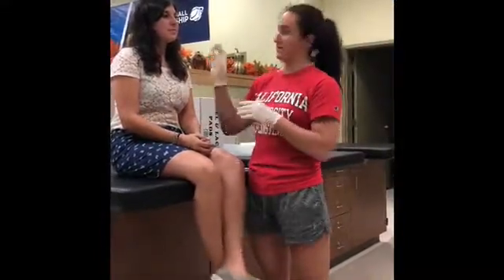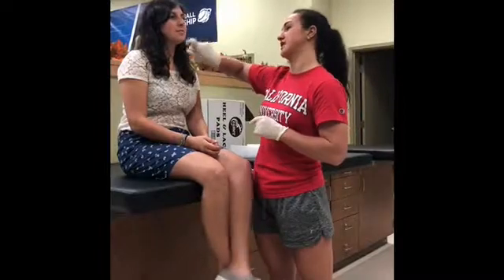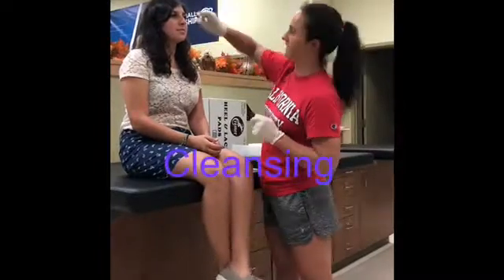First I put my gloves on. I put a towel around her so we didn't get anything from the laceration on her. We're going to take the spray saline and spray the area to clean it.